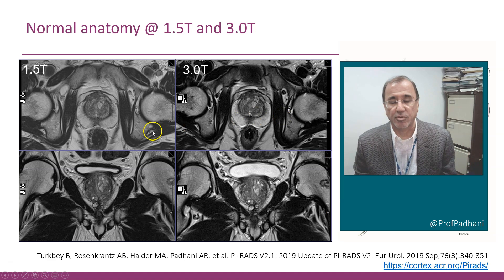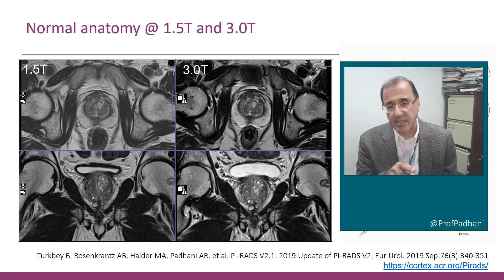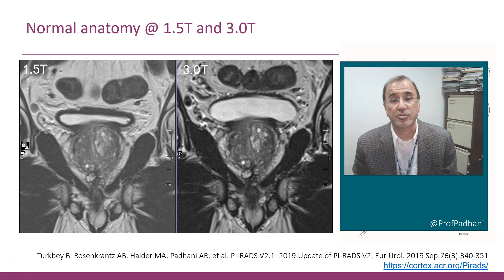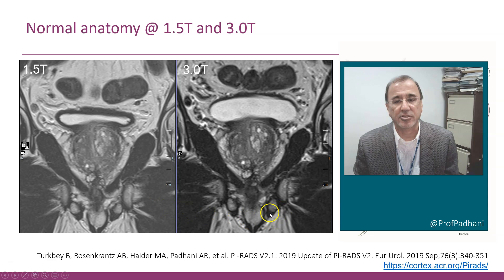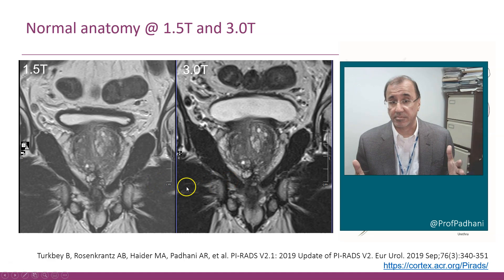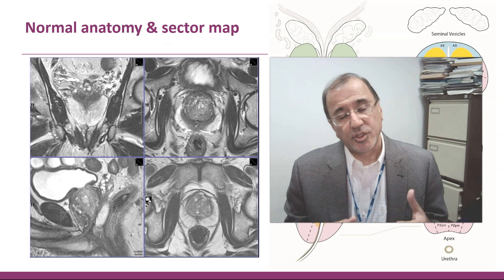What's the difference between 1.5 Tesla on your left and 3T on the right? It's all about resolution. Let's take the lower two images and magnify those. Looking at the glandular structures in the left transition zone, and these BPH nodules — this is 1.5T, this is 3T on the same patient, and you can see the resolution is quite different.